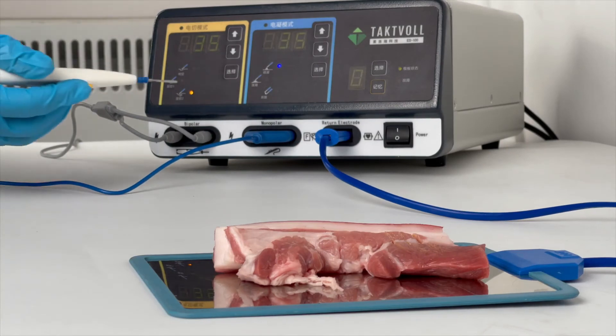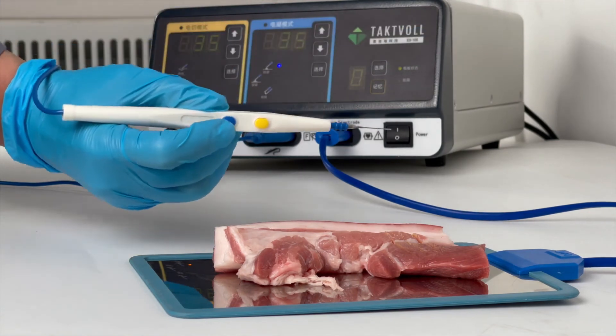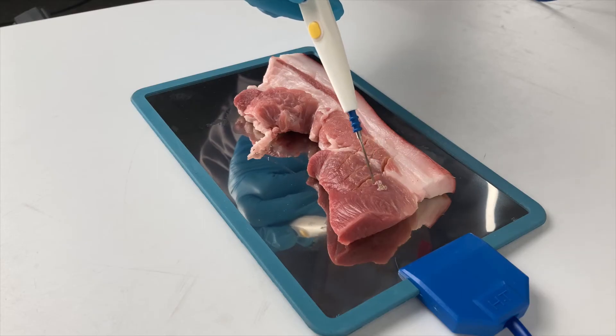Next, demonstrate the Spray Coagulation Mode. Power is still 35. Press the blue button. It's visible that the coagulation effect is very fast.